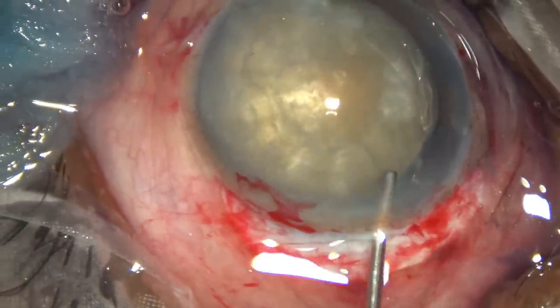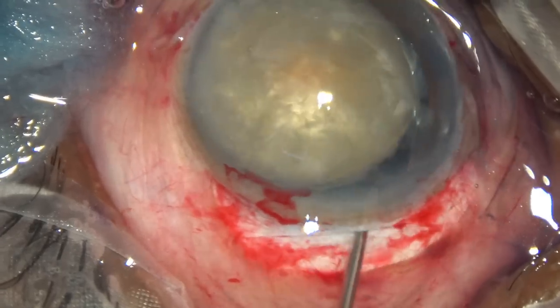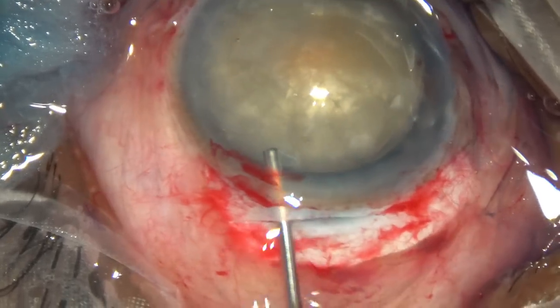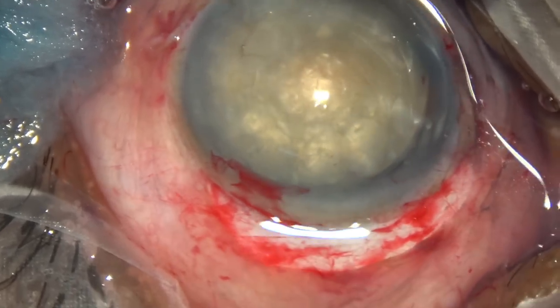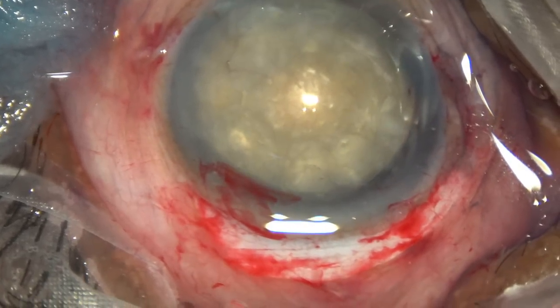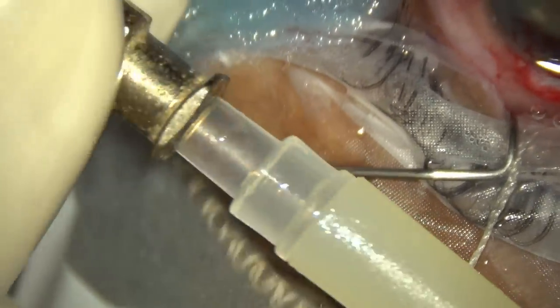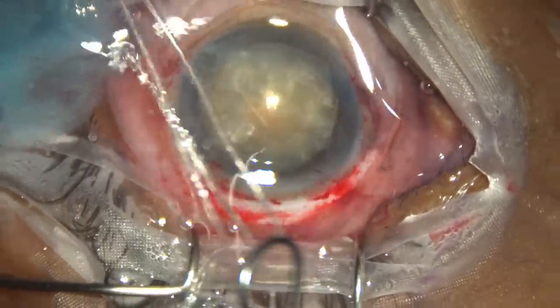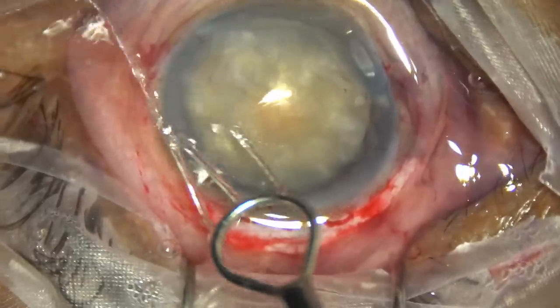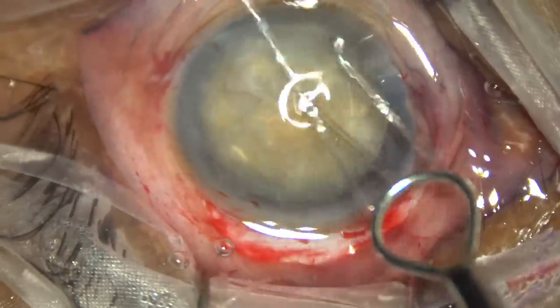Now injecting visco in front of the nucleus and behind the nucleus. This is an irrigating vectis. It is attached to a drip set. I don't have to push the fluid through the syringe, so my hand is more stable.